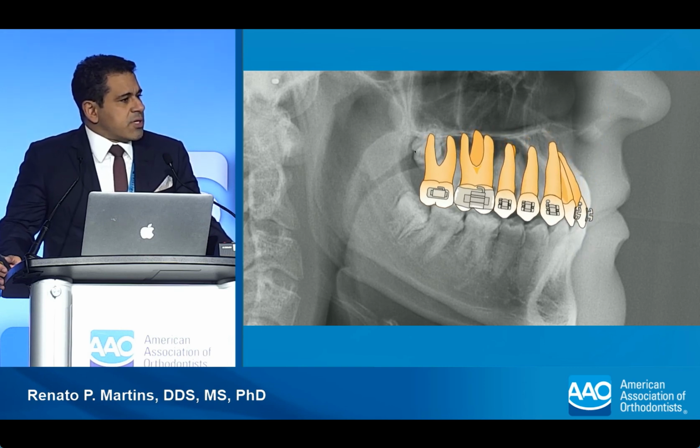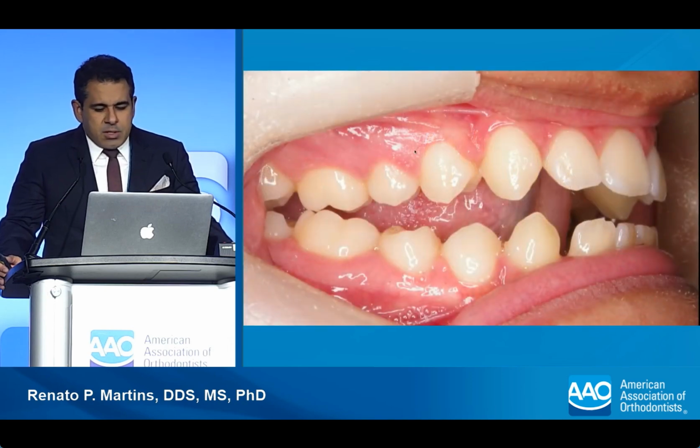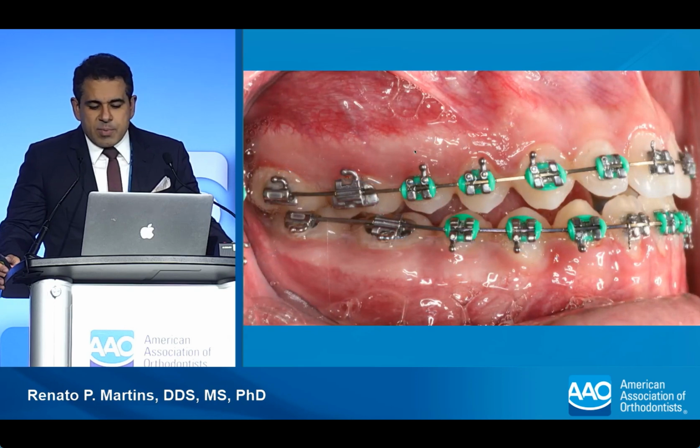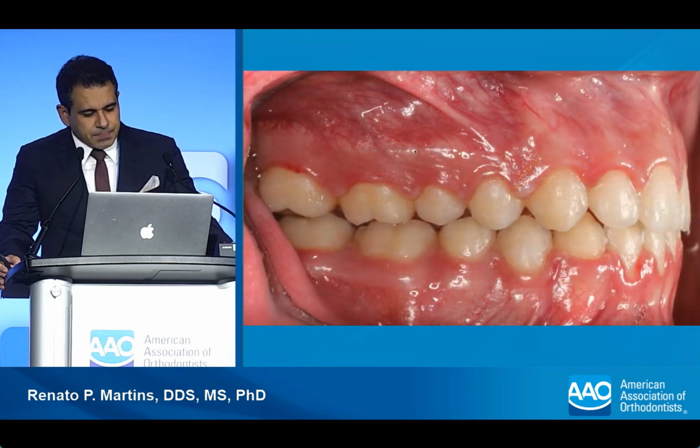So whenever you're doing step bends or trying to close anterior bites, it's a good idea to use anterior box elastics. Even if you use reverse curves, which you can with NiTi, it's a good idea to use the open box or the anterior box elastics in order to close the bites.